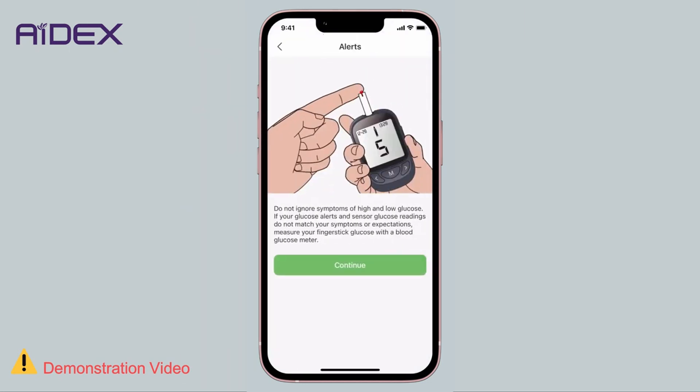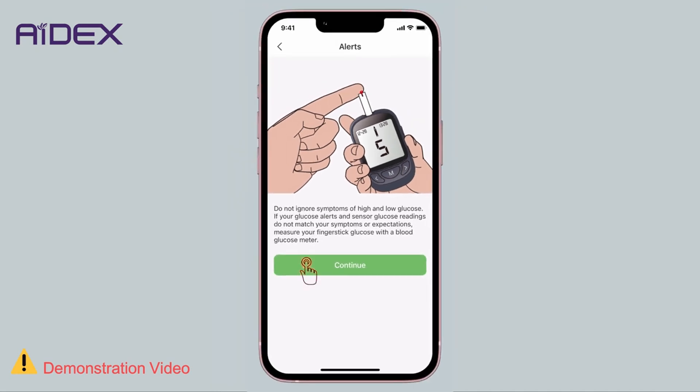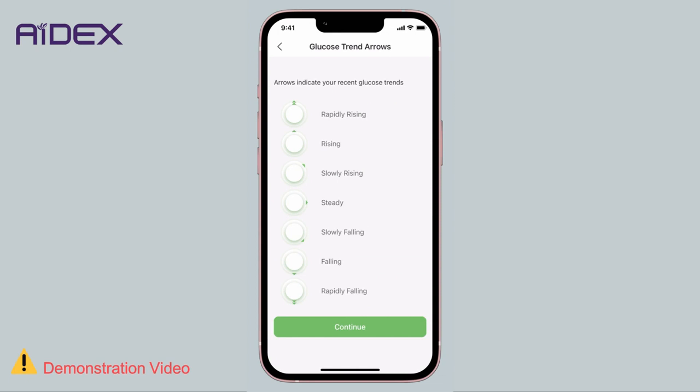Tap Continue. A confirmation message will appear reminding you to pay attention to symptoms of high or low blood sugar. If, at any given time, the app's readings do not align with these symptoms, it is advisable to check your blood glucose using a home testing kit. You will then encounter a screen providing information about the arrows displayed in proximity to the app's readings.